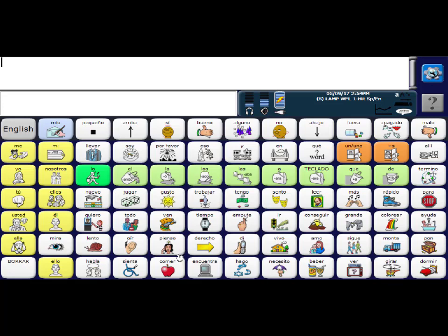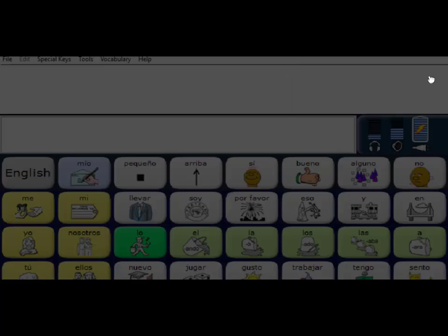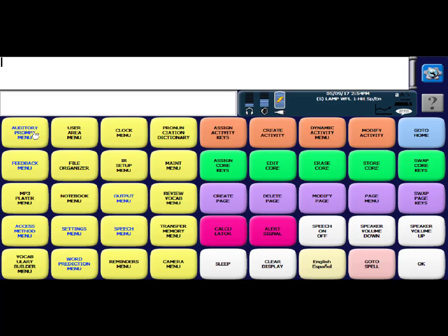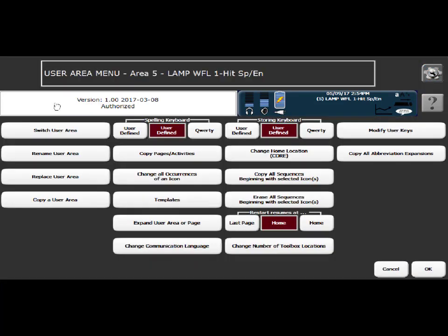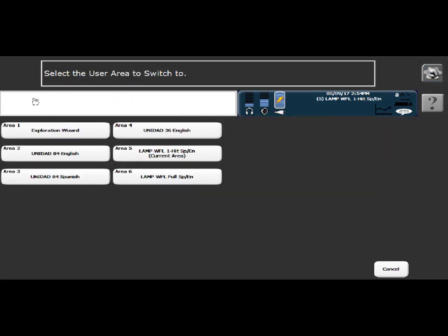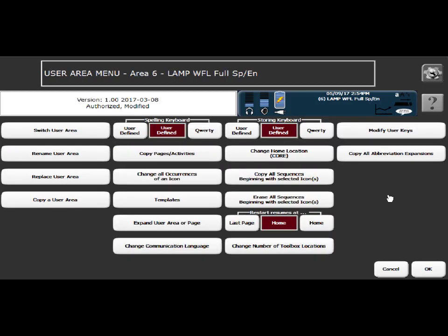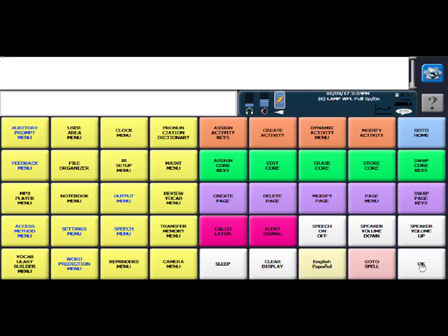So now I've loaded in the one-hit version of the program. If you want to gain access to the full vocabulary, you're going to go the gray wheel here and head into the toolbox, go to the user area menu, and then select switch user area. And at this point you can move over to the full program and say, okay, and go to home.